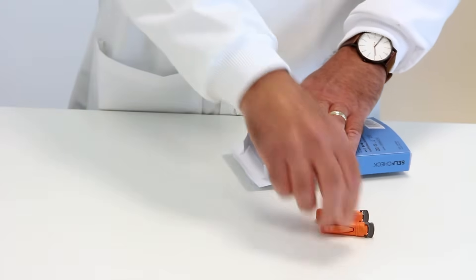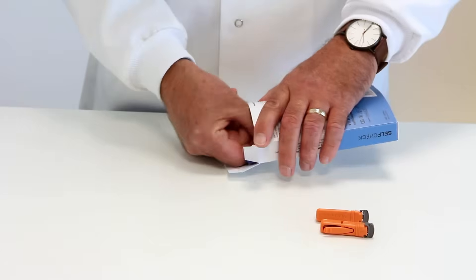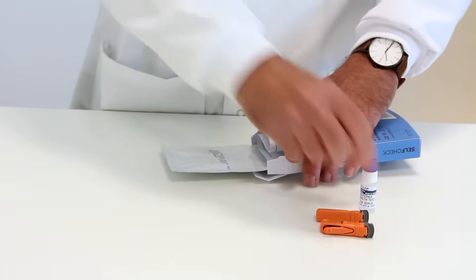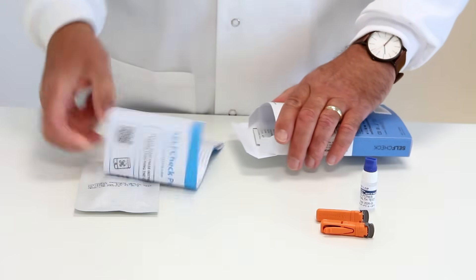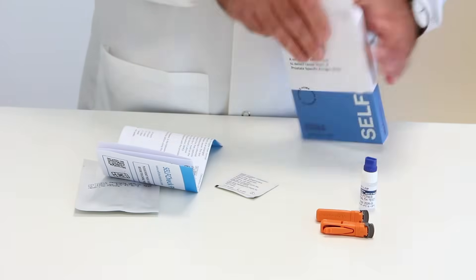Inside, you will find two sterile lancets, a bottle of diluent, a foil pouch containing the test cassette, the instruction leaflet, and a sterile swab.